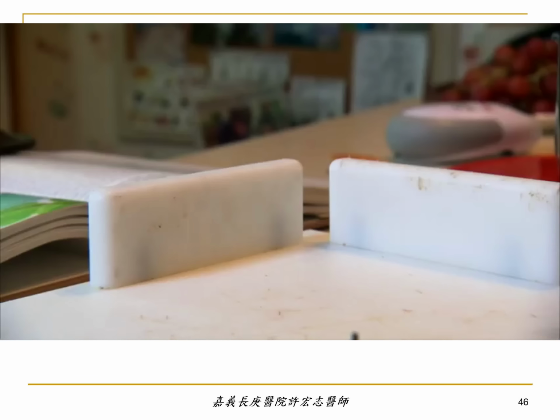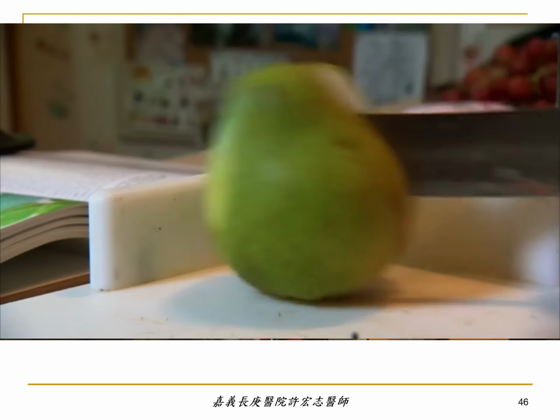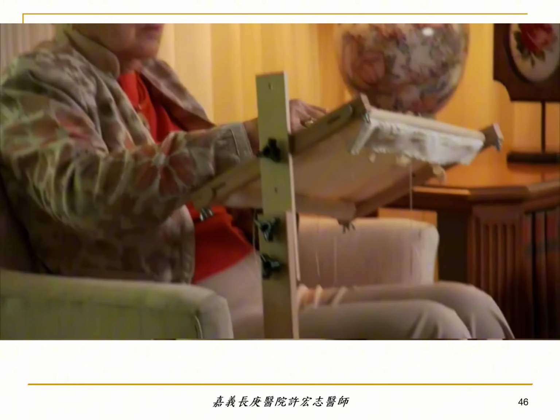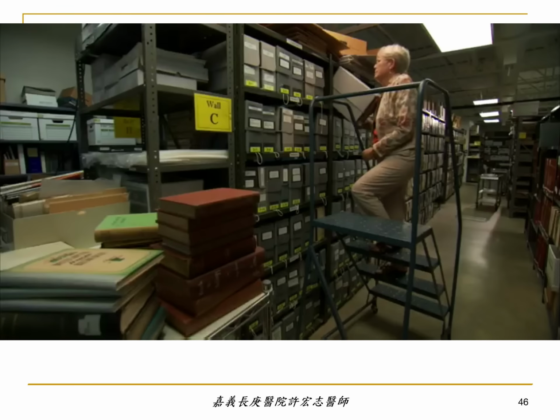The thing I use the most is my cutting board. It has 2 supports in the back that hold like an apple or anything I want to slice. The needlepoint frame that I have has an arm that goes down and a piece that goes under my legs, and I can do my needlepoint just fine that way.